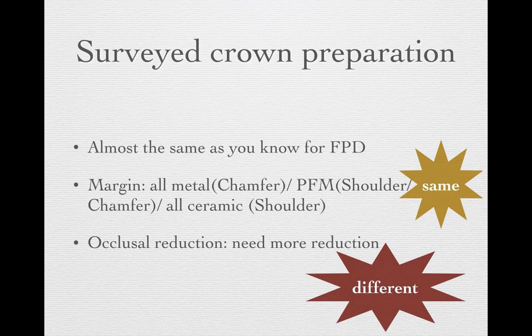A very common question that I get when I work with your seniors on survey crowns and RPDs in the clinic is: how about the survey crown preparation? Is it different from the regular crown preparation? Actually, the answer is almost the same as for crown or bridge preparations. The margin preparation also relates to the material you're going to choose for the patient.